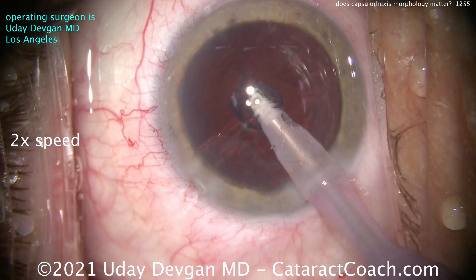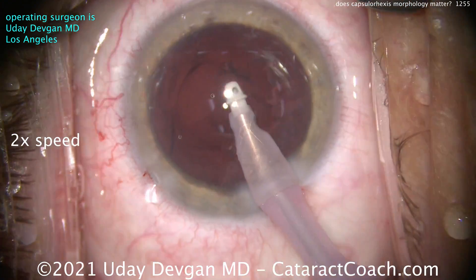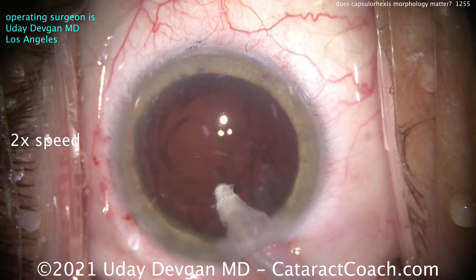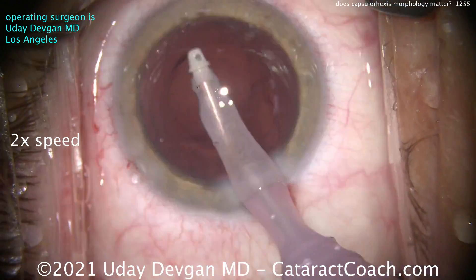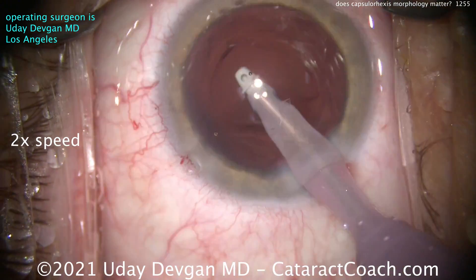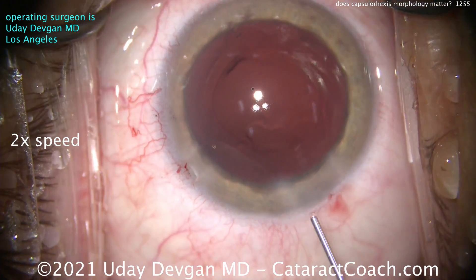When femtosecond lasers first came out about ten years ago, we heard a lot of marketing that making a perfect rhexis would give you a better effective lens position and more accurate post-op results. I don't think it made much of a difference — in fact, studies have shown that it didn't. So if you overlap the optic for most of its circumference, I think you're going to have the same refractive outcome whether or not it was a perfect five-millimeter circle.